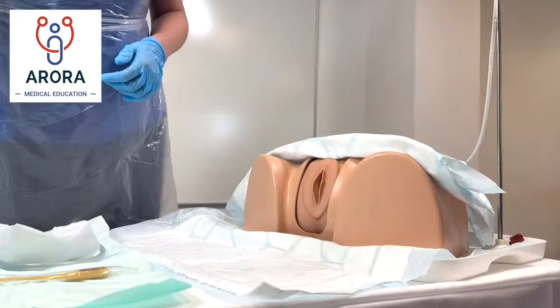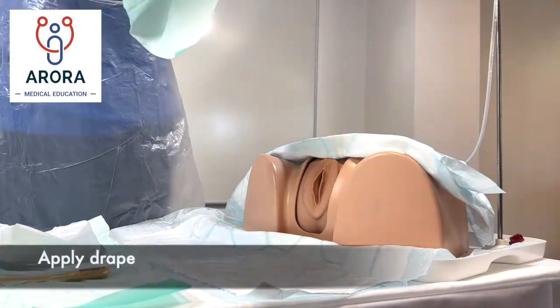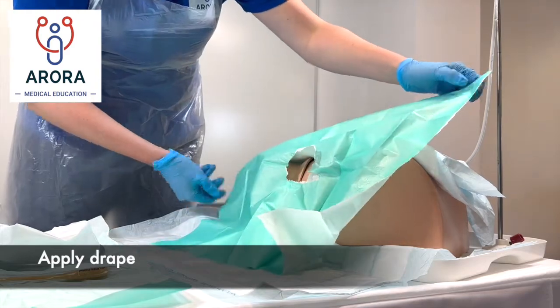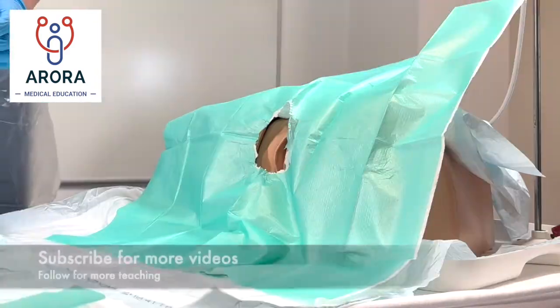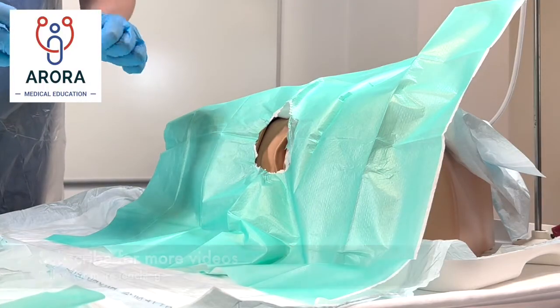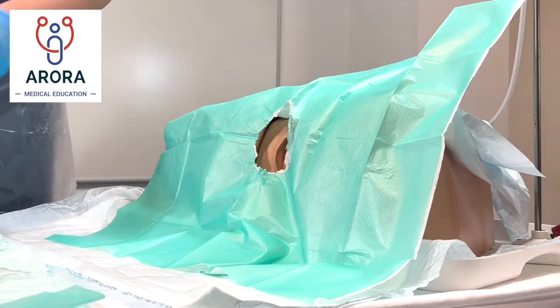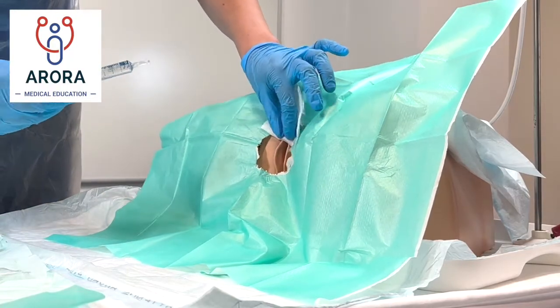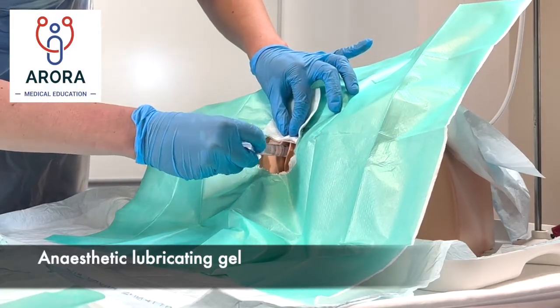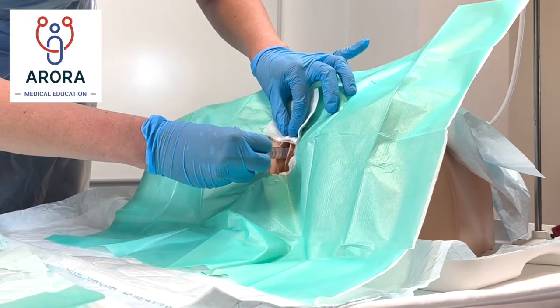Next we'll put the fenestrated drape over the patient to keep the area clean. Then we're going to insert the anesthetic lubricating gel — slowly, warning the patient that it might sting as it goes in. Insert just into the urethra and slowly insert the gel.